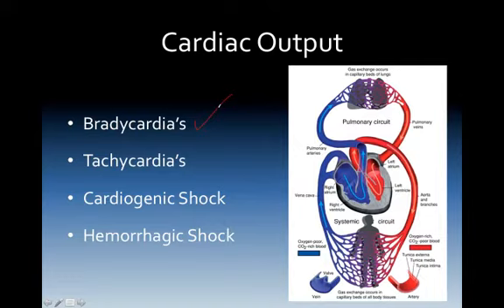In tachycardias, consider an SVT or VTAC with a normal end-tidal CO2. This would suggest that the patient is tolerating the tachycardia okay. But in the normotensive patient, if the end-tidal CO2 is decreasing, that states poor perfusion. So we could actually see them going into an unstable tachycardia kind of coming.